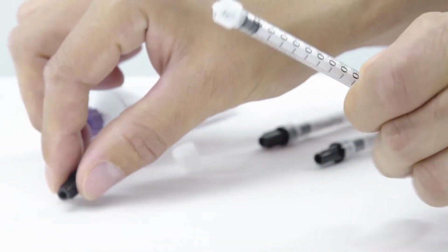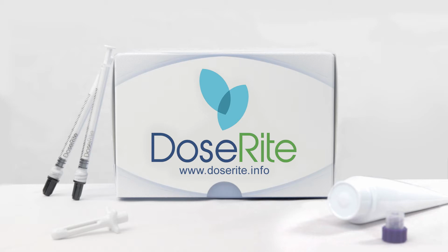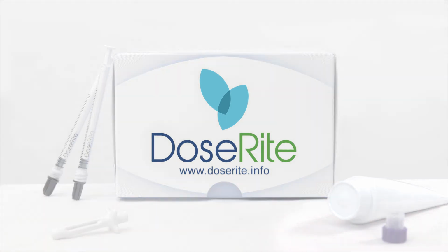Wash syringe with warm water and store for future use. If you have trouble inserting the applicator all the way, or you experience any pain, try a different self-medication position or have someone help you apply the medication. A lubricant such as Aquaphor can be used to help with insertion.